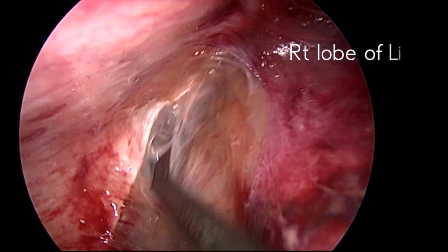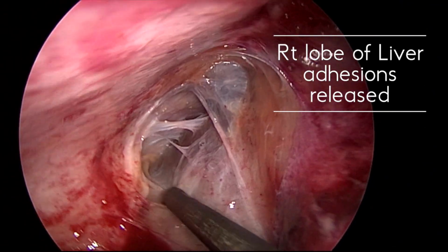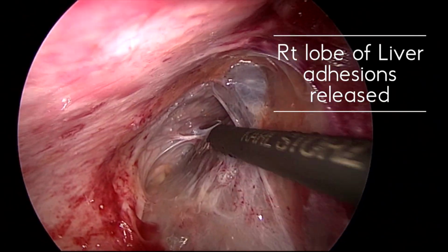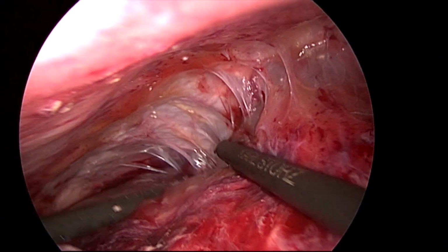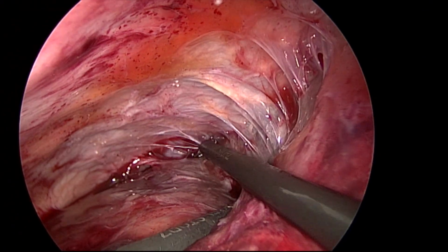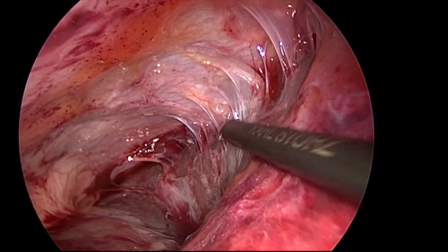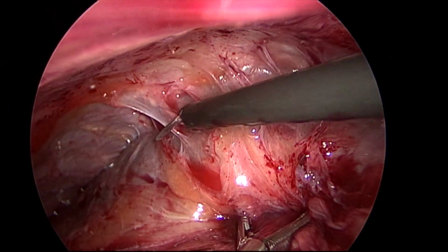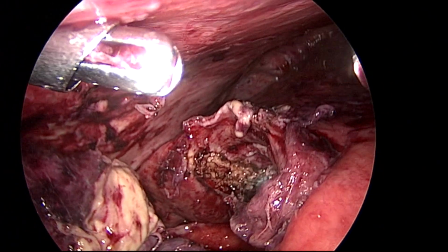See, now these are all things to be released. Otherwise, these collections will produce subdiaphragmatic collections. The patient might get pleural effusion and breathing difficulties, and delayed recovery will be there. So all these things will be avoided by doing this step. And after this, I have to wash very thoroughly with saline, around 3-4 liters or 5 liters of saline, so that the entire debris will be taken out and the bacterial load will be reduced.